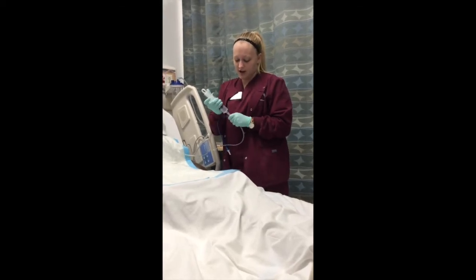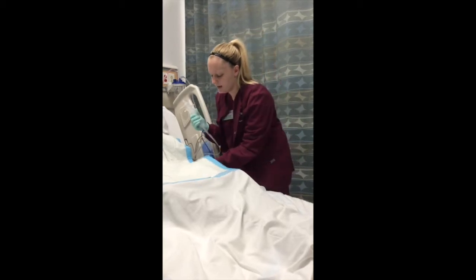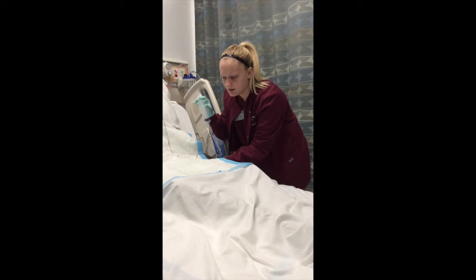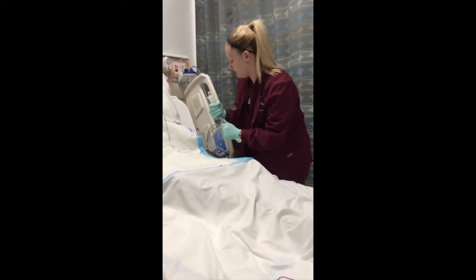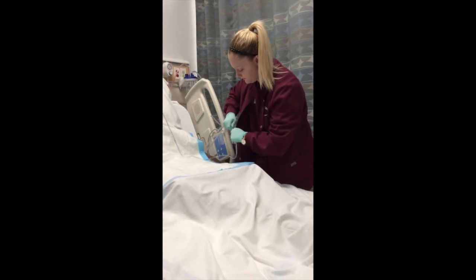I'm going to go ahead and hook this up with air. I'm going to take my stethoscope and put it on their belly. I'm going to be listening to their belly while I do this, listening for bubbles, and okay, I hear bubbles. Great. It's placed correctly. I can go ahead and hook up my suction immediately.